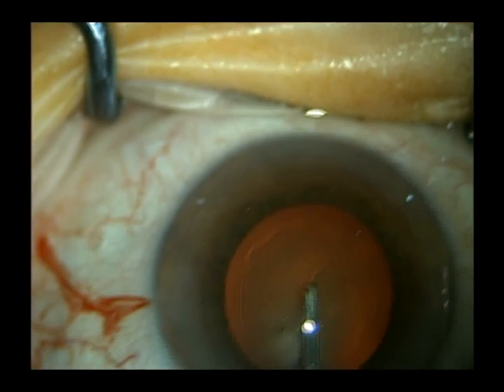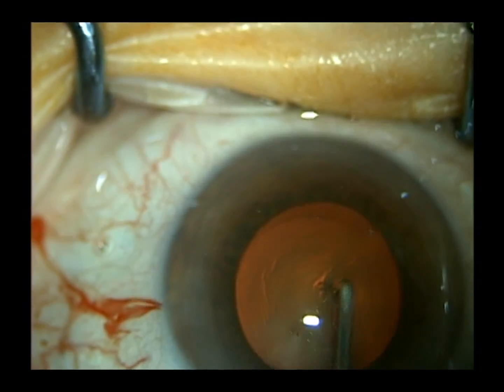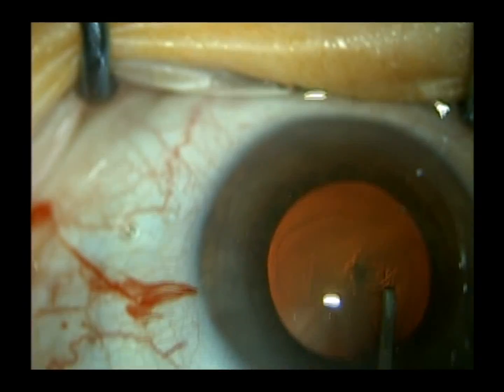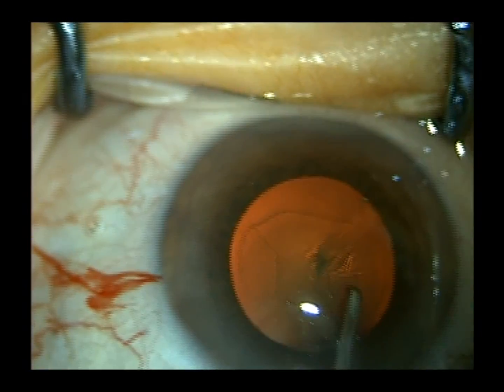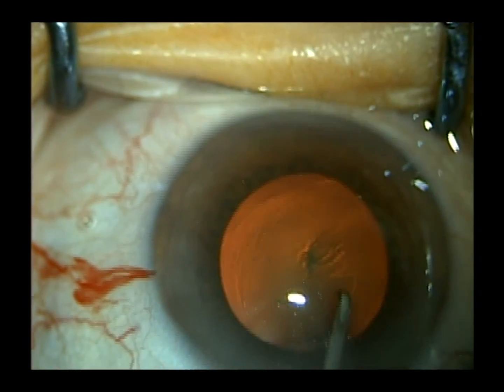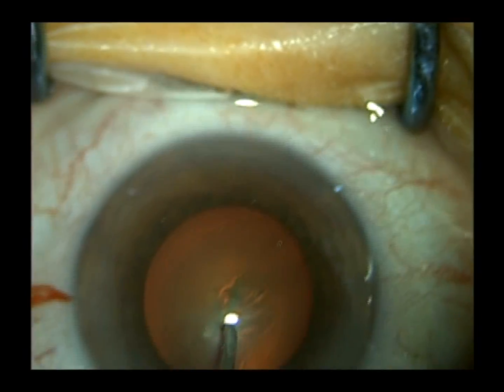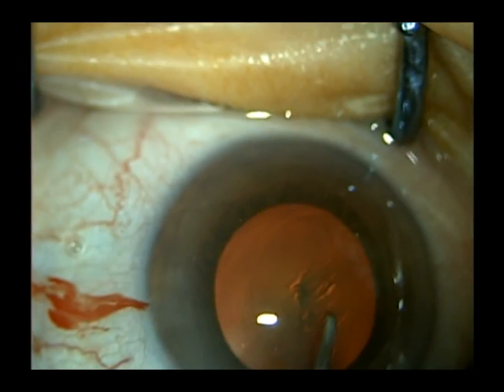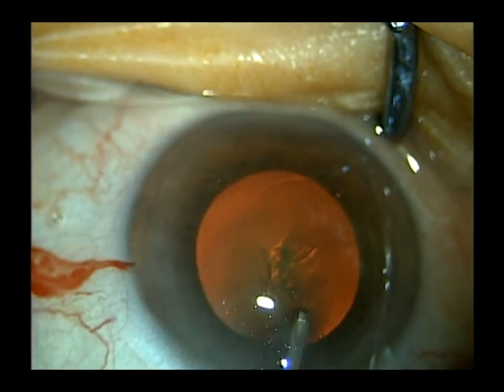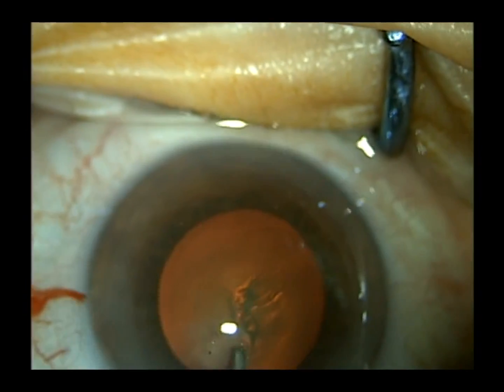And as I'm working on the eye, I'm starting to recognize that my 6 millimeter pupil is now moving closer toward 5 millimeters. Any shallowing of the anterior chamber will produce corneal stria, which will prompt me to reinflate the anterior chamber by infusing more OcuCoat through my bent needle cystotome.